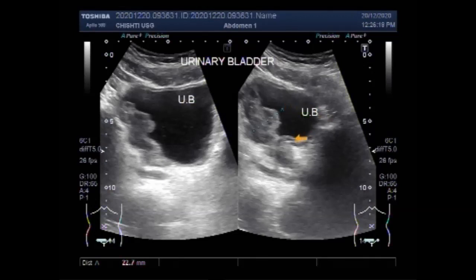Bladder ultrasound can show how much urine the bladder holds when it is full and whether someone completely empties the urinary bladder when urinating, and the residual volume of the urine can be measured, and it will show the incomplete evacuation of the urinary bladder and the extent of the residual volume and the extent of the urinary obstruction. Bladder ultrasound is often done along with the ultrasound of the kidneys.